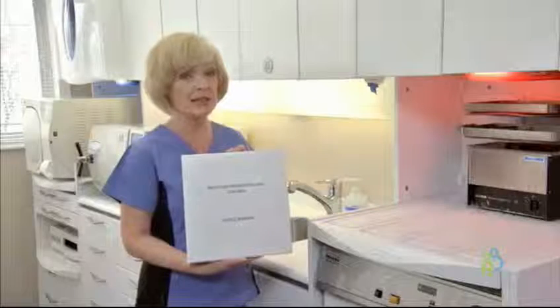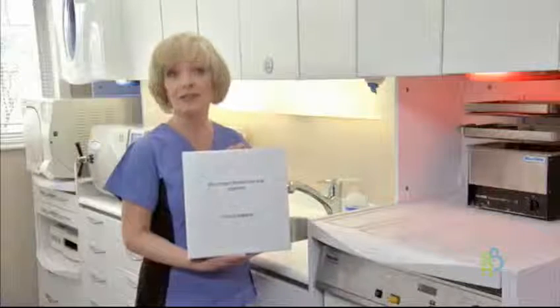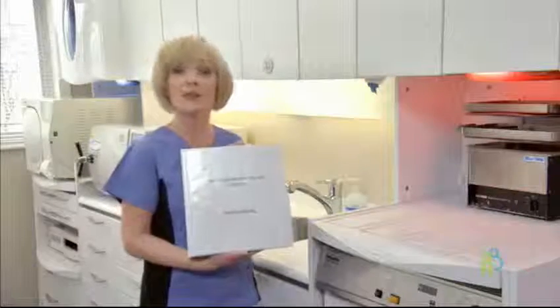One person should be designated to oversee the development and implementation of this document within the clinic, but the ultimate responsibility rests with the principal dentist. Office-specific reprocessing procedures should be written in a step-by-step manner so that a new staff person would be able to reprocess devices by referencing the manual.